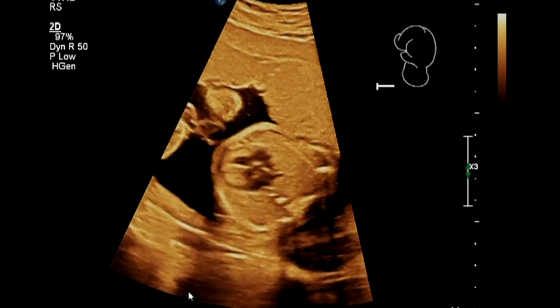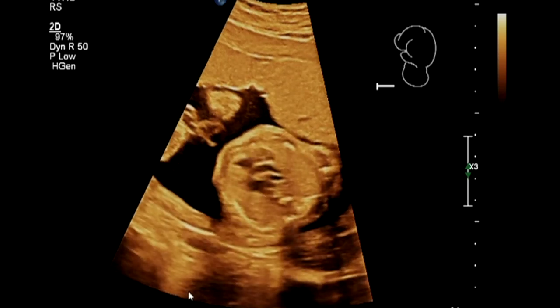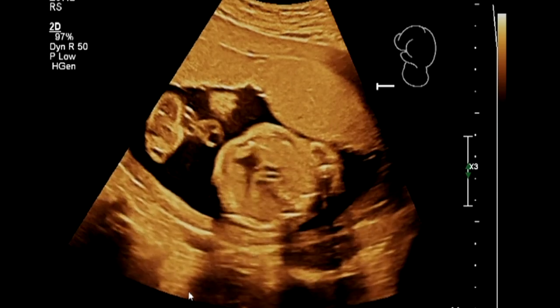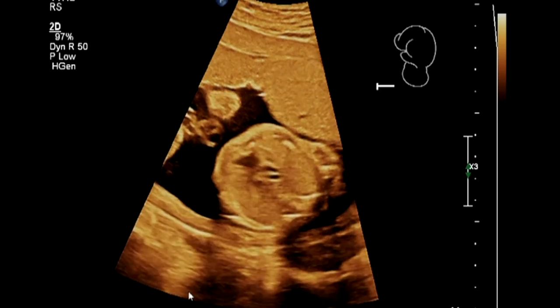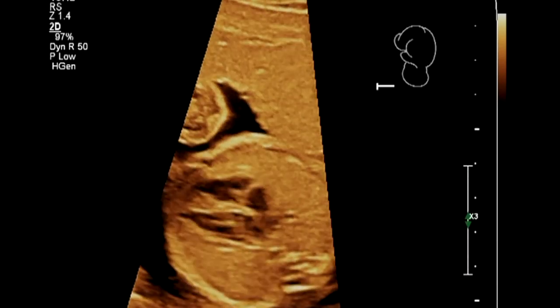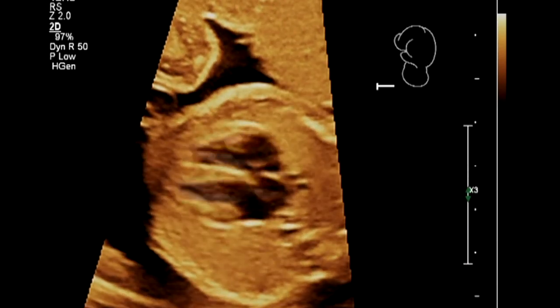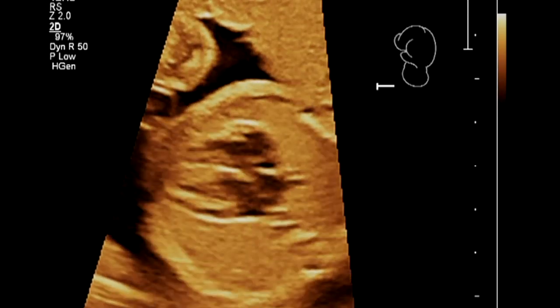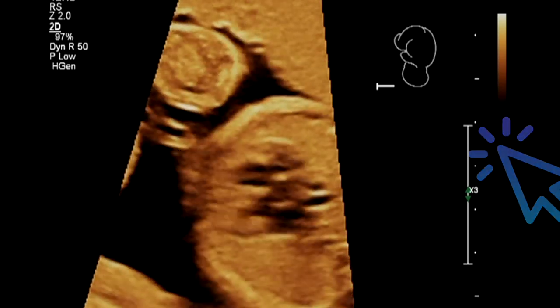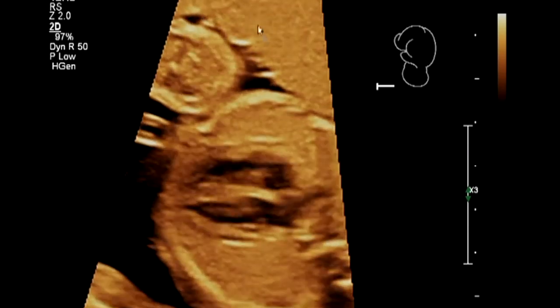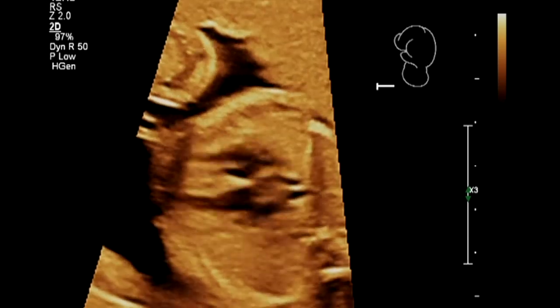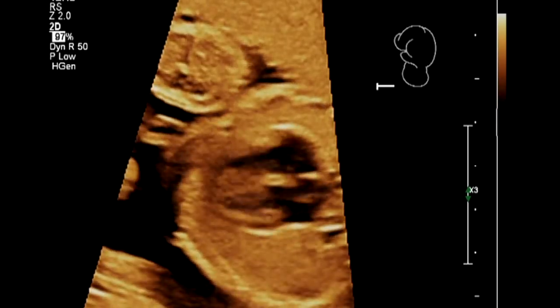Now we can zoom in and start to look at the heart. I'm going to talk about some of the techniques we discussed earlier. I'm going to narrow the sector so we don't waste resolution, and now I'm going to adjust the depth to make sure the focal zone is where we want it — not up here, not down there, just right. We can see it's not perfect because the placenta is anterior.